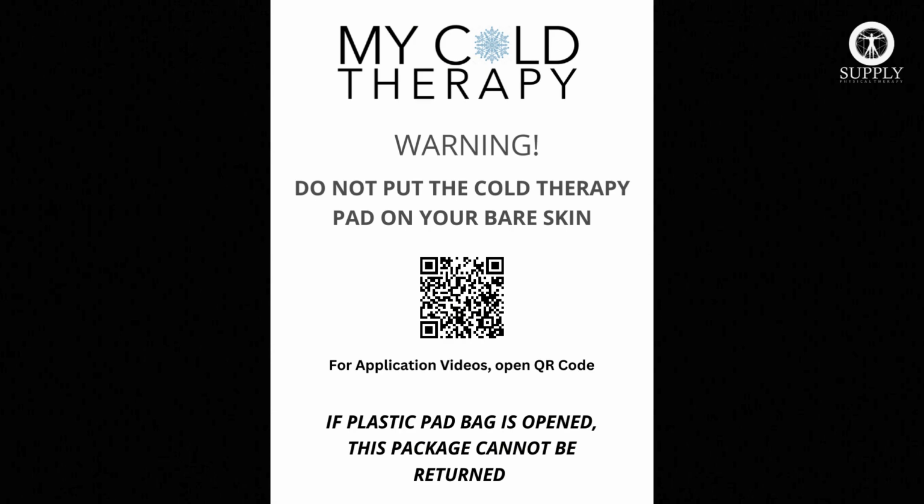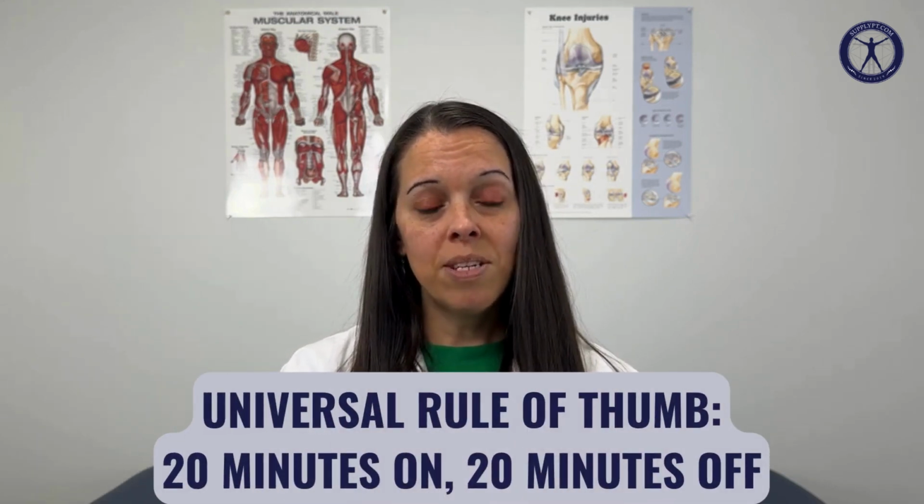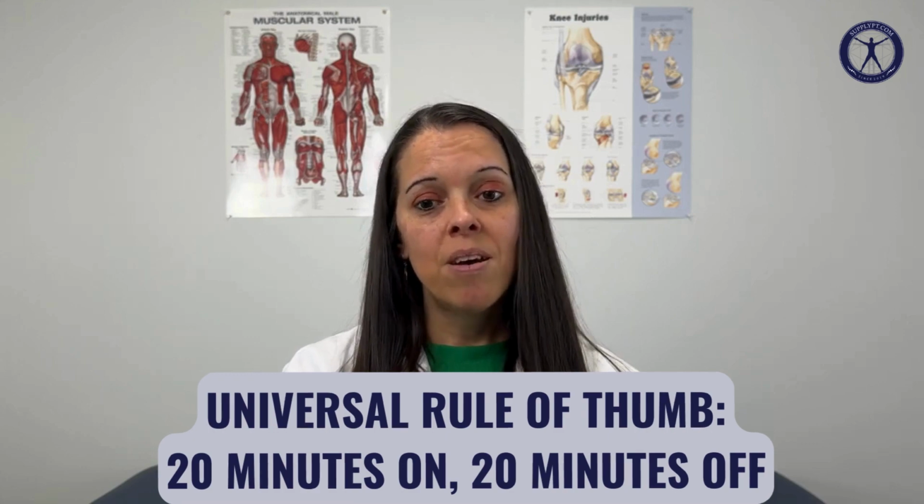The other item you're going to get is a skin warning flyer. You never want to put the cold pad directly on your skin, as it could cause some damage or some frostbite. And the universal protocol for cold therapy is 20 minutes on, 20 minutes off. Also, please make sure to check with your doctor for any other instructions while you're using the cold therapy device, just to be on the safe side.